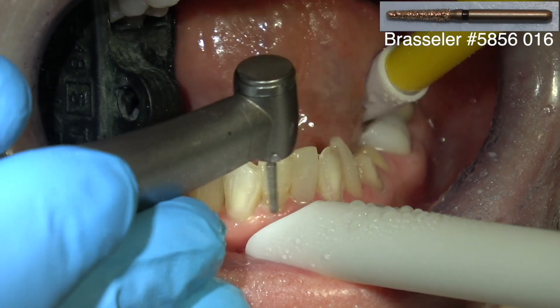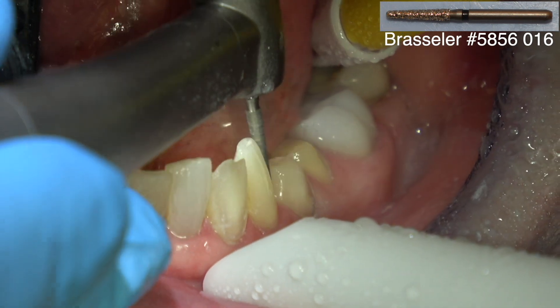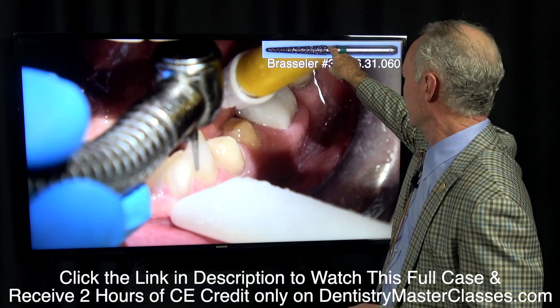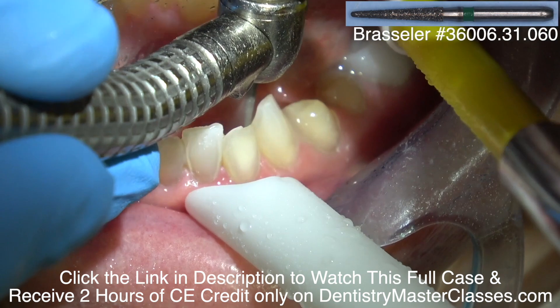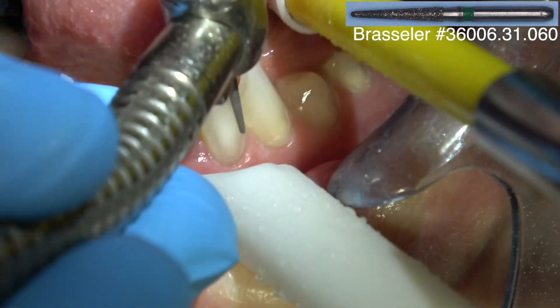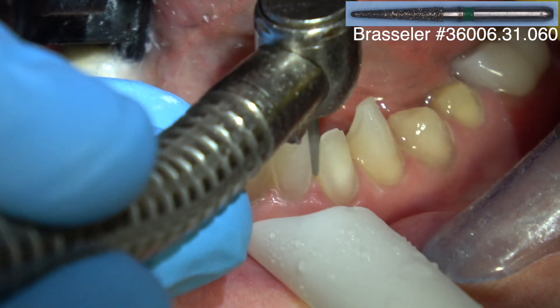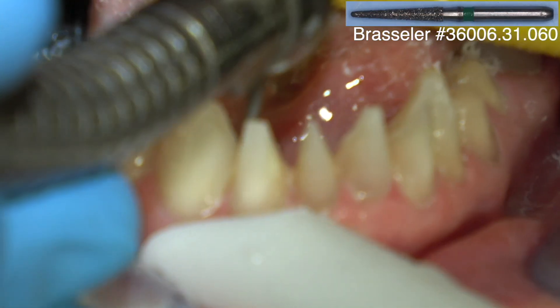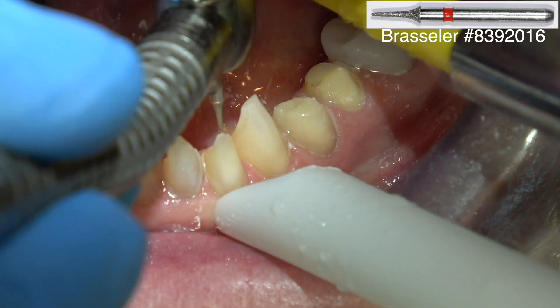Once you've accomplished that, you can begin the reduction for the veneer, which is about half a millimeter from the alignment when the teeth are in the correct arch alignment. I'm cutting between the teeth and I like this burr because it has a straight side — I want to cut straight between the teeth. You've just got to be sure that these preps — the interproximal preps and the facial prep — draw, so the provisionals will draw and the veneer will seat. If this part of the tooth is still contacting, we'll come back with a mosquito diamond and break that contact. The mosquito diamond also has straight sides, so you know the prep will draw.